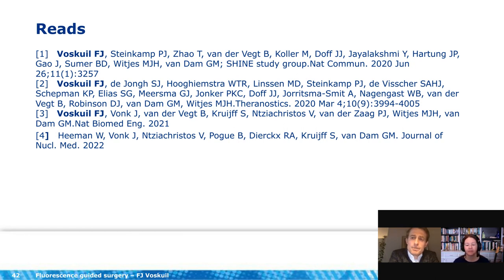That is a great question. I think it depends on the resolution of your camera as well, and of course the quality of your compound. In the first study, where we used cetuximab, we detected a tumor lesion of around 2 millimeters. And in the second study I showed, we were even able to detect a 1.5 millimeter satellite lesion. So around 1, 2, 3 millimeters when using the current devices available.